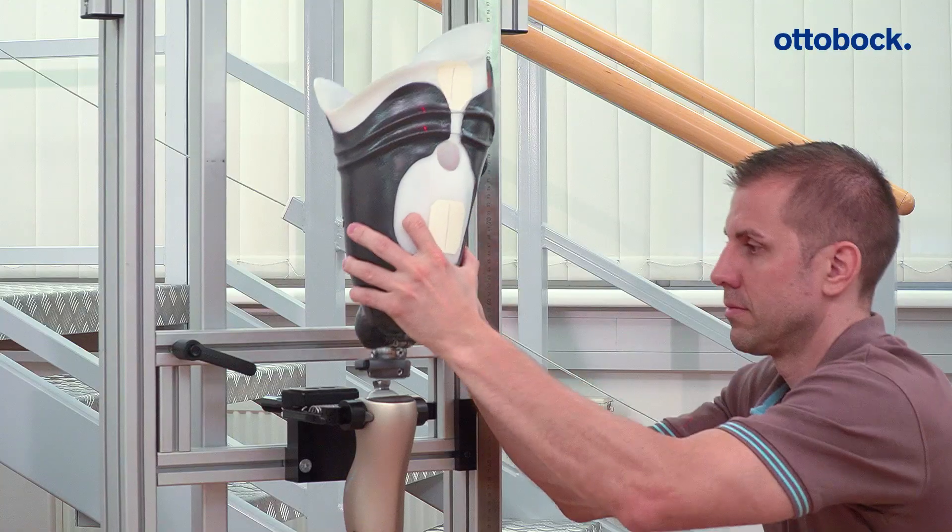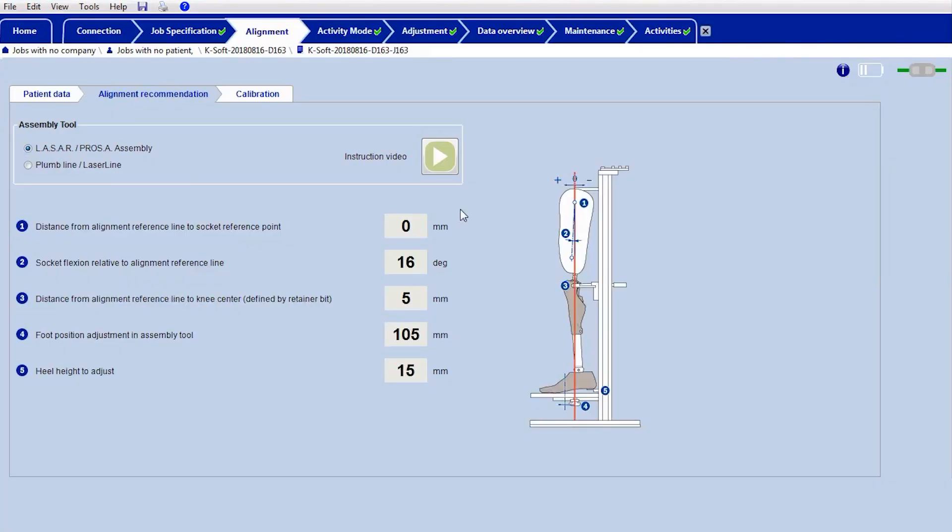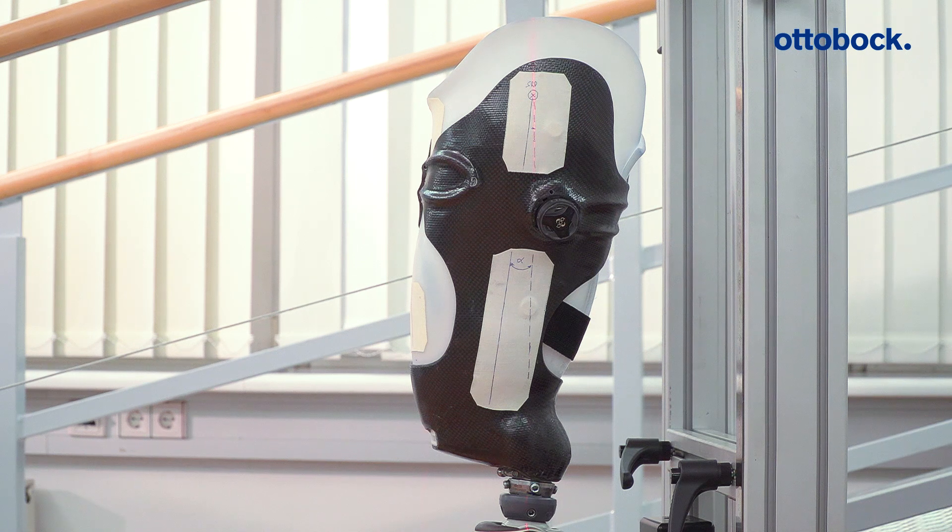Then connect the socket to the knee joint. Pay particular attention to the socket flexion angle and socket position specified in the alignment recommendation and adjust the components accordingly.